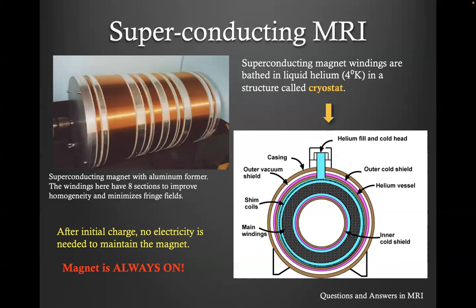And the helium is getting pumped and circulating to cool this magnet. And the compressor is just going to make noise. If you go to an MRI room, you're going to hear that chirping sound. That's how helium is getting pumped into the MRI to cool the magnet, the circuits that run the whole magnet.